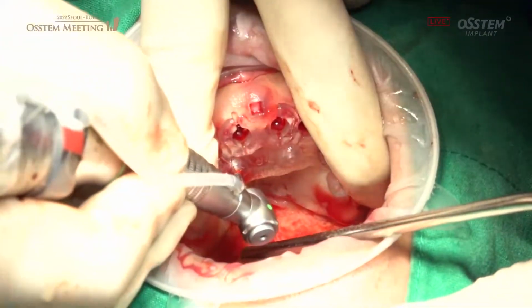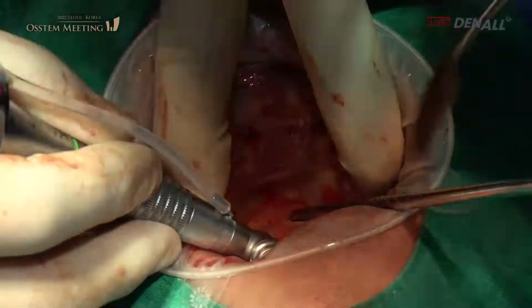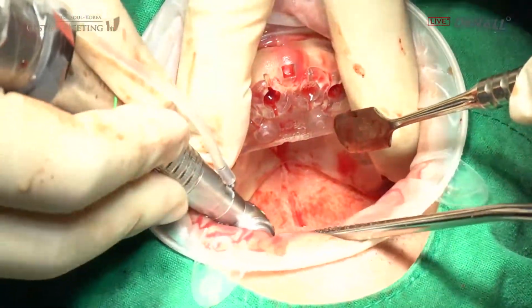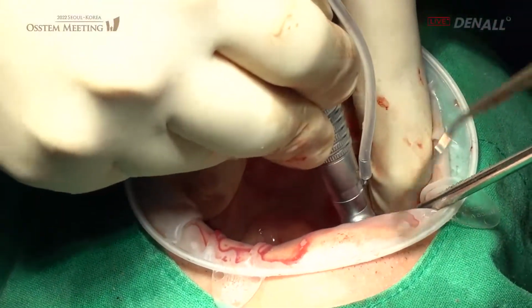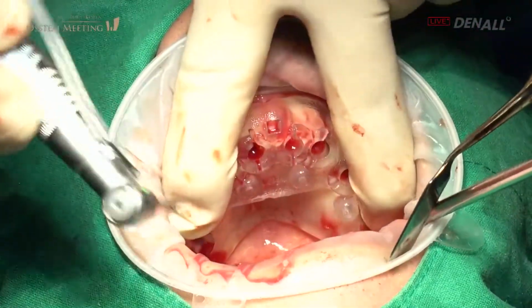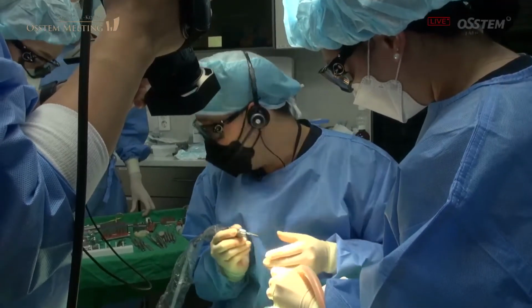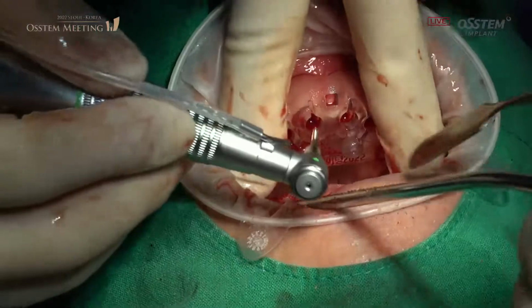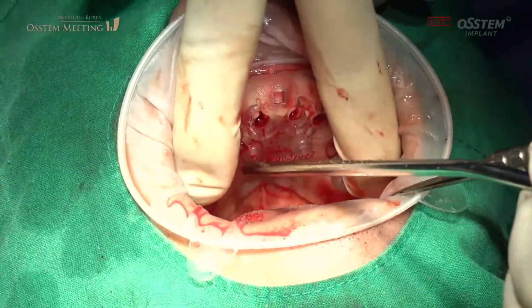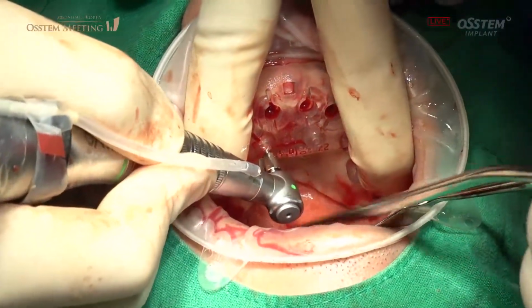Can you say "ah" for the lateral anchor? To the maximum? So in the planned positions, the guide is fixated. Do you feel pain?